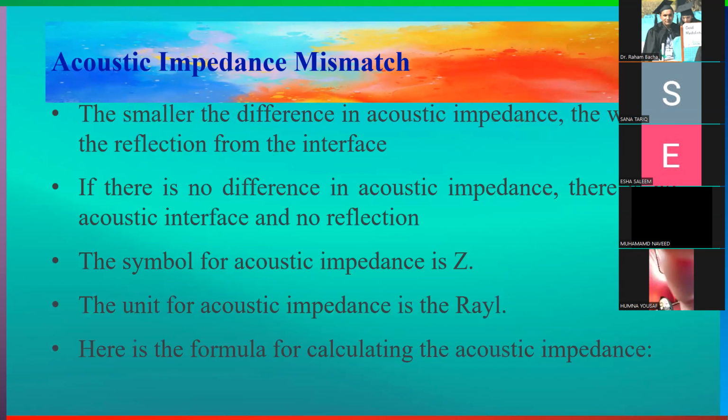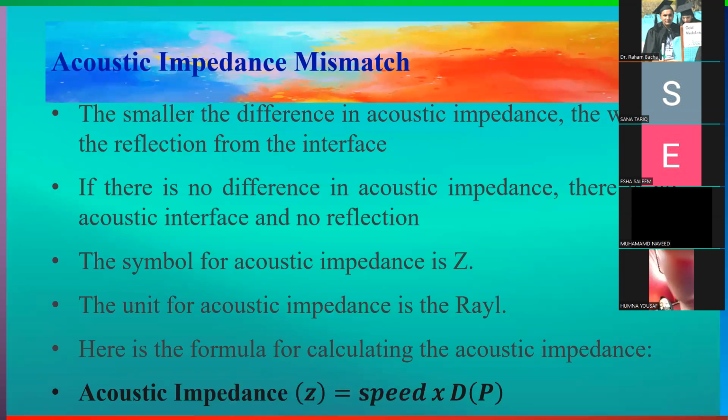Both of them, density and speed of sound, depend upon the medium, right? What is density? You know that the mass per unit volume is called density.